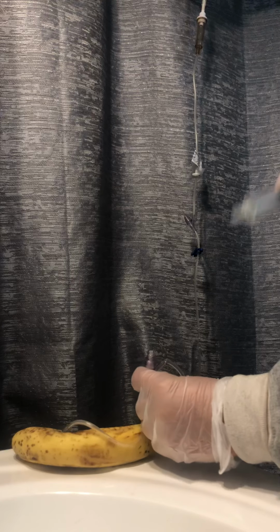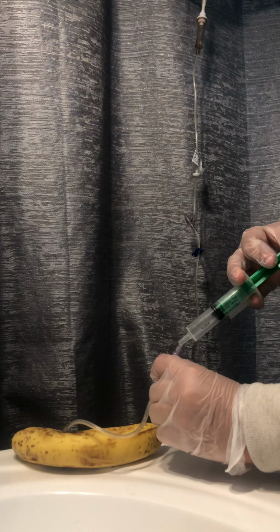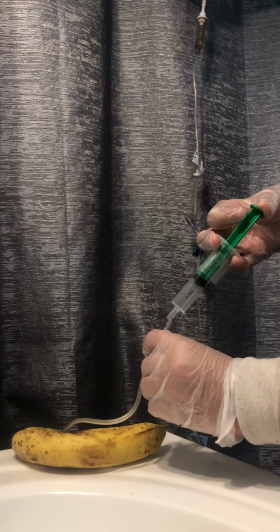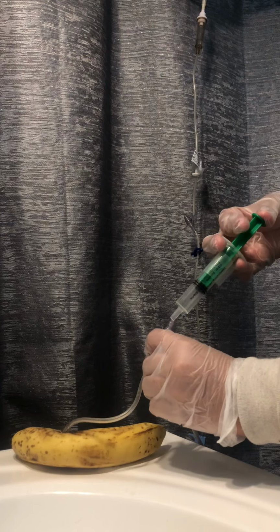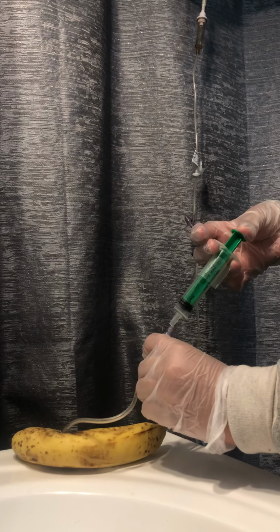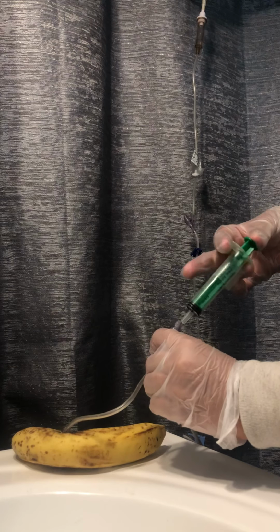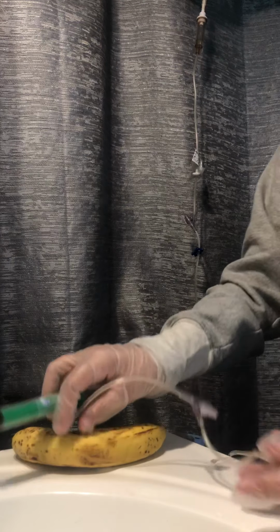We're going to put it in slowly, holding the pinch continuously. Slowly. Okay, we administered our Lasix.